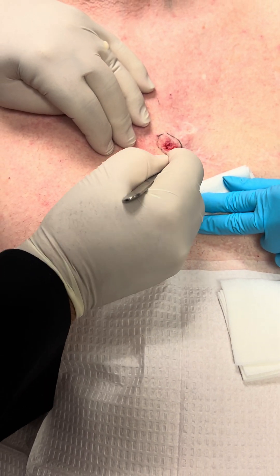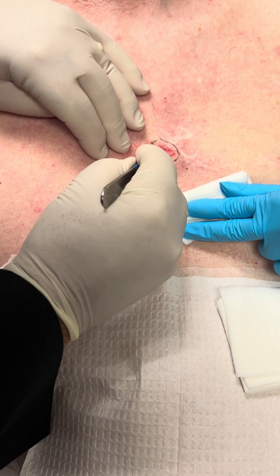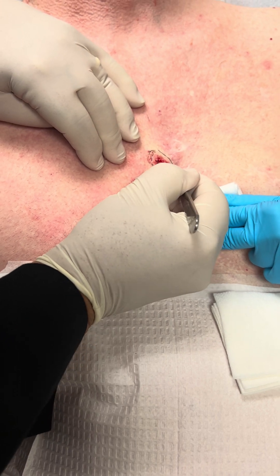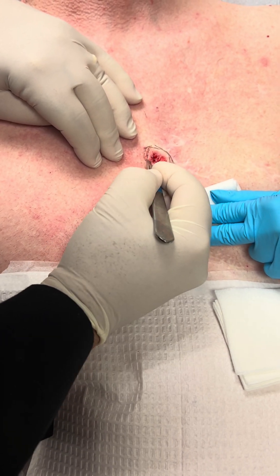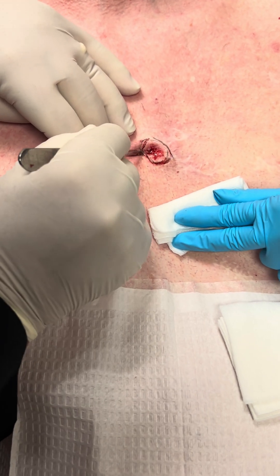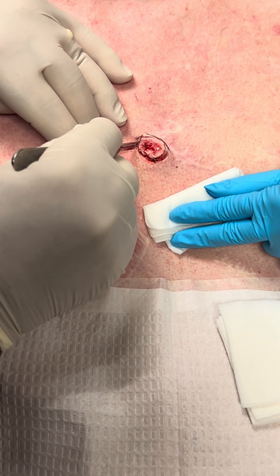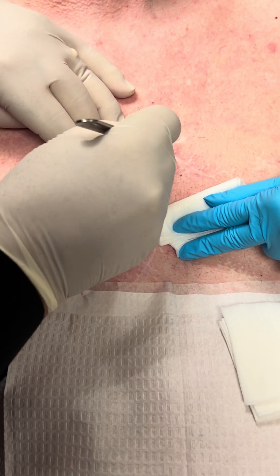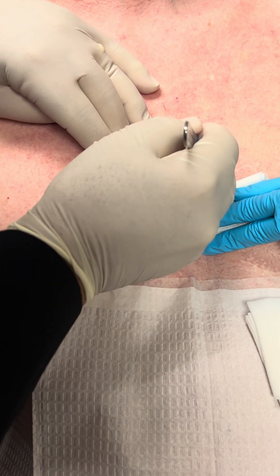You want to do anything, Jeff? Just a pinch. You felt that pinch?